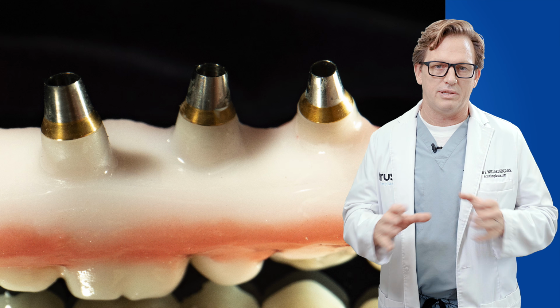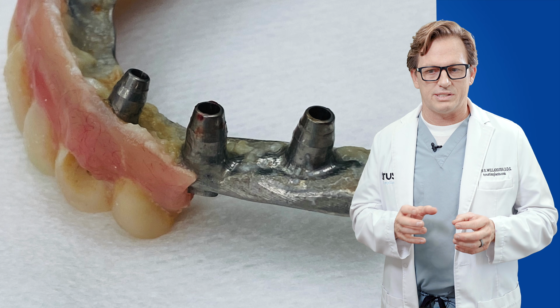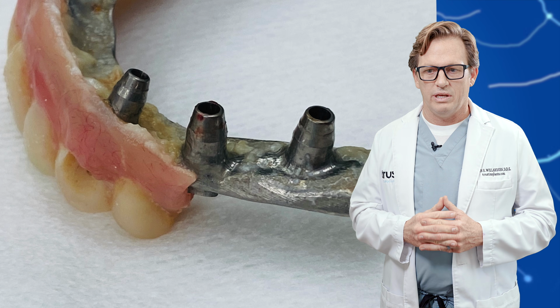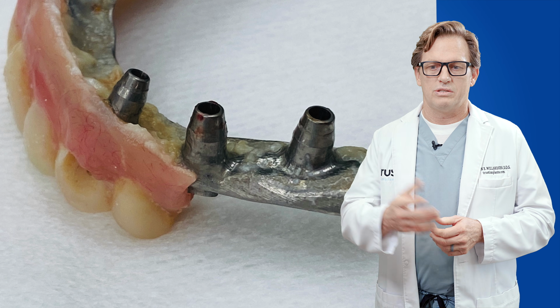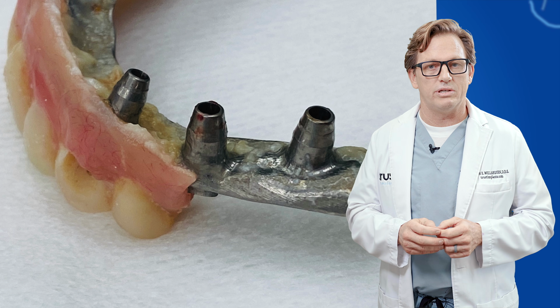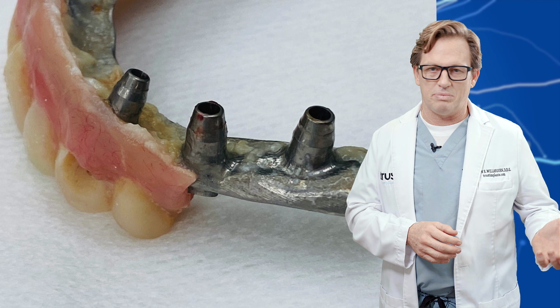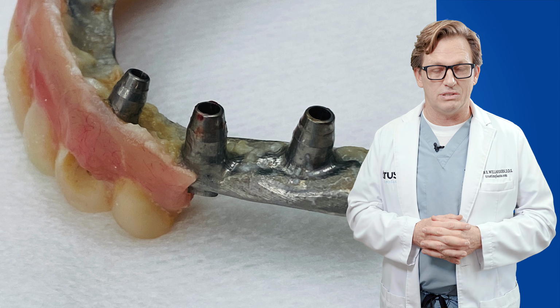They don't have to deal with any issues in the future. And just take a look at the difference in the prosthetics. So here's a case that we had to take out and redo. And look how dirty and how tarnished this metal is. So this patient had no idea the type of metal that was put in her mouth on this hybrid. So this is a hybrid of some sort of metal and plastic. Of course, the plastic broke off the metal piece, and now she's left to have to redo this case.